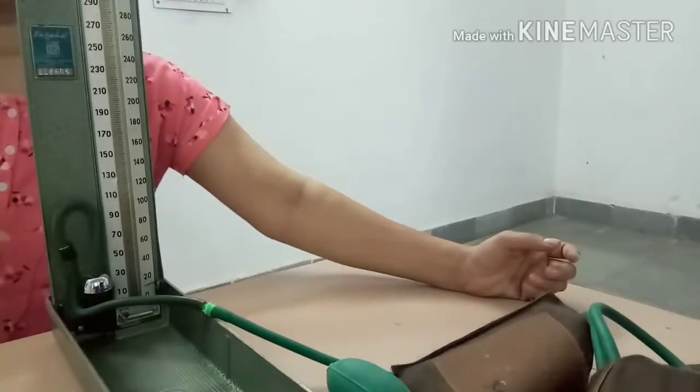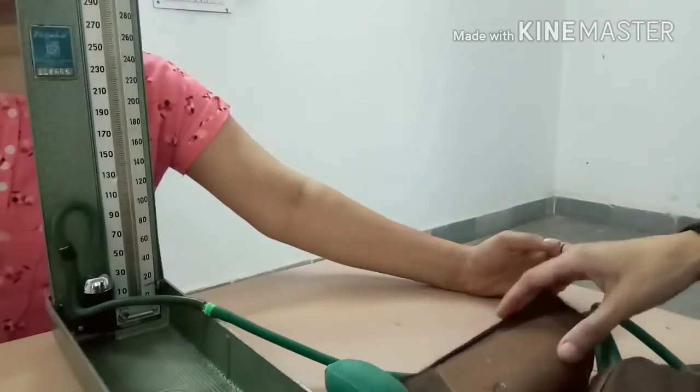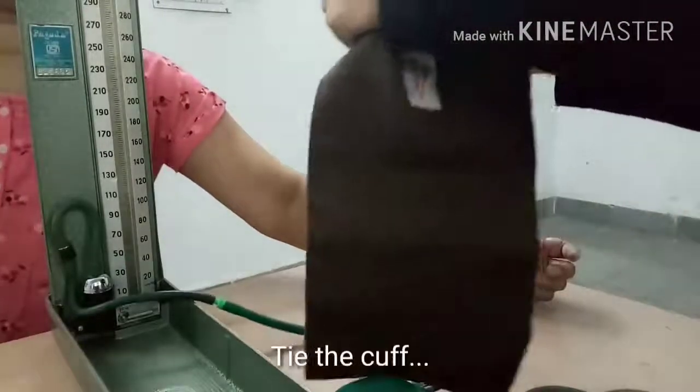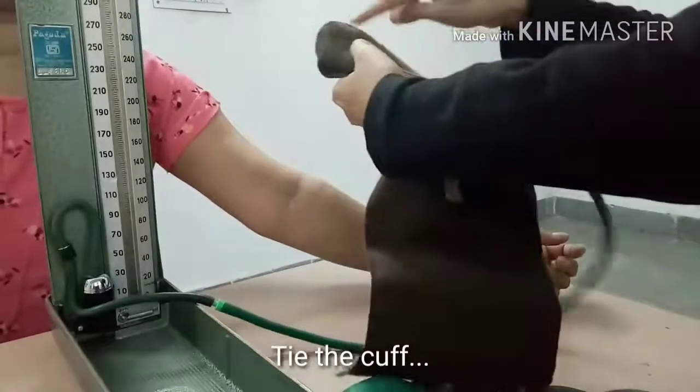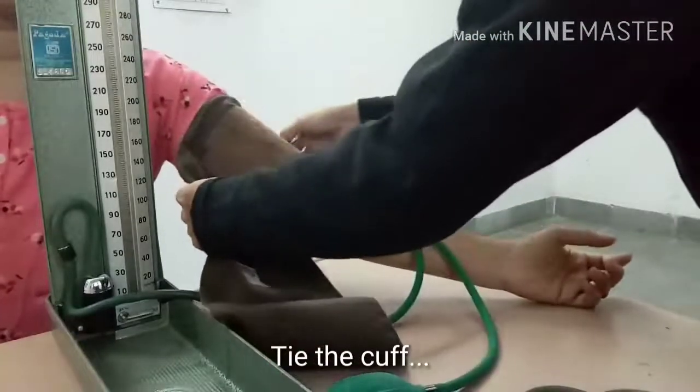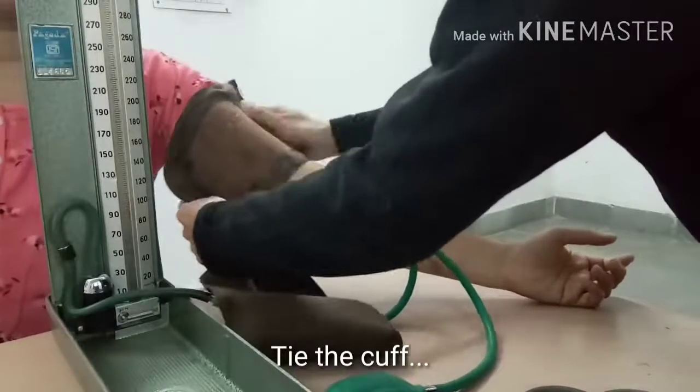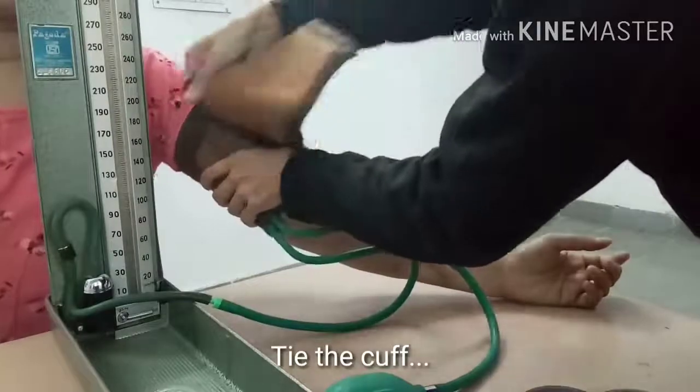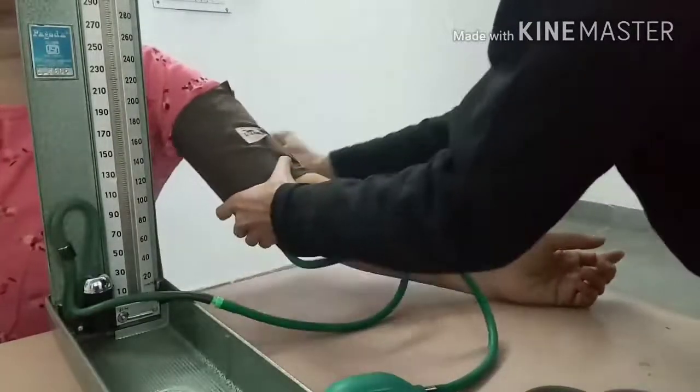Keep the cuff at heart level of the subject. Palpate the brachial artery. The cuff should neither be too tight nor too loose. This way we can tie the cuff.